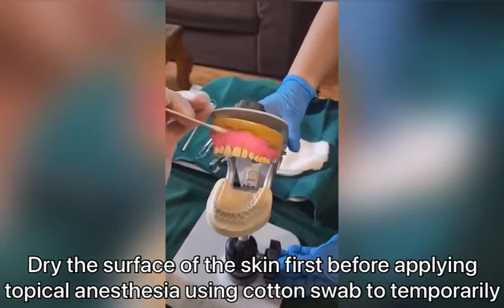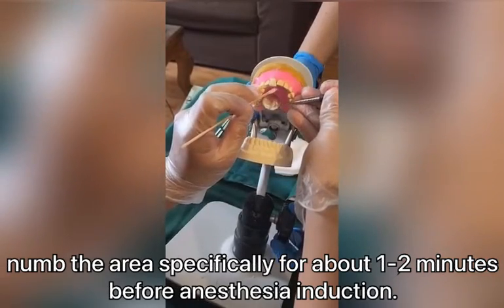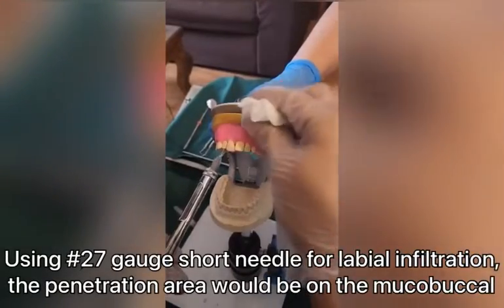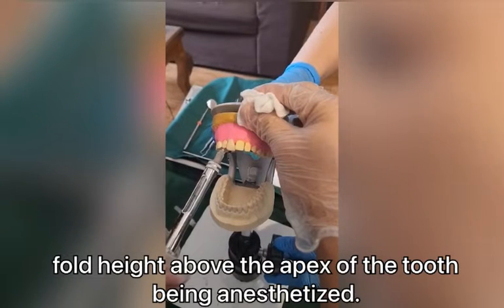Dry the surface of the skin first before applying topical anesthesia using a cotton swab to temporarily numb the area specifically for about 1 to 2 minutes before anesthesia induction. Using a number 27 gauge short needle for a labial infiltration, the penetration area will be on the mucobuccal fold height above the apex of the tooth being anesthetized.